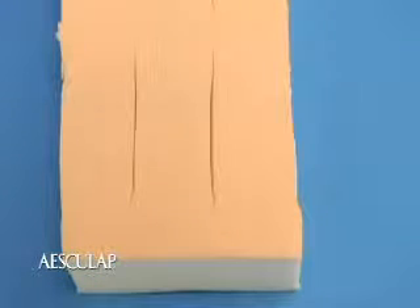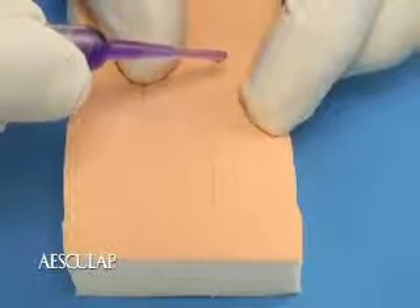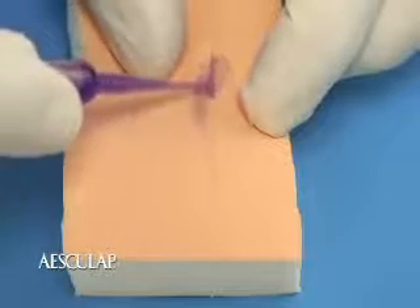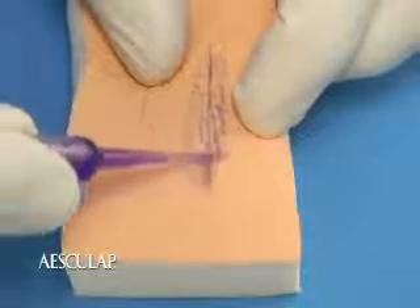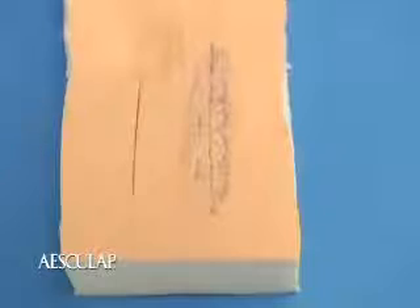Once the adhesive is spread out, you're done. The other method is a continuous flow technique. All the preparation for this technique is the same as before, only the application differs. To apply, squeeze the adhesive out in a continuous layer while moving along the wound or incision. You must maintain a positive pressure on the ampule during the entire application process.